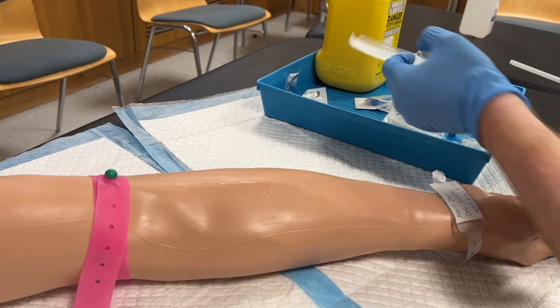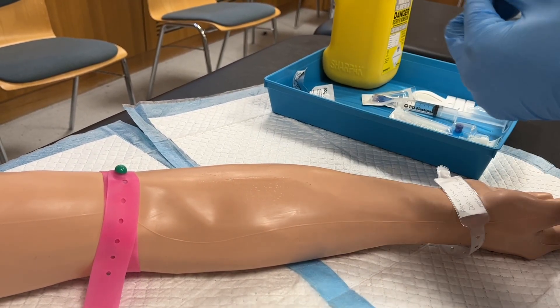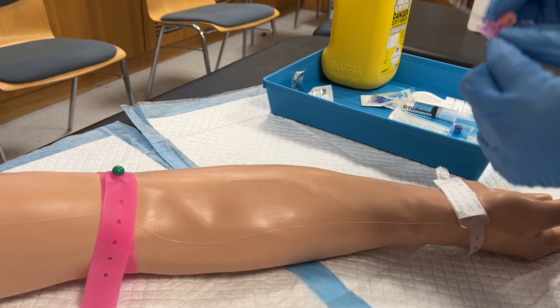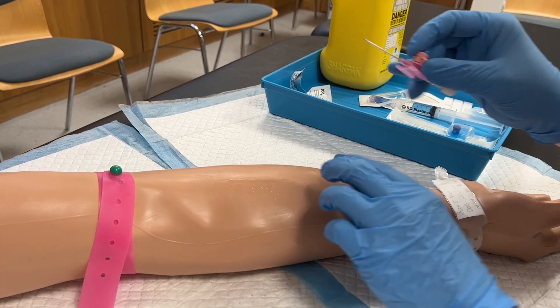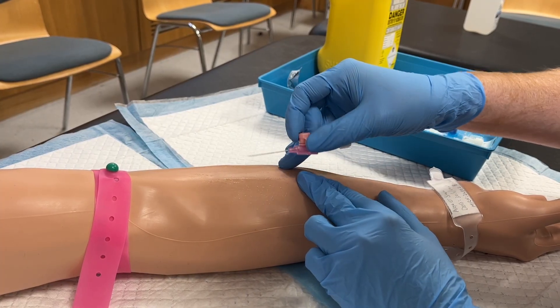Ensure that the bevel is facing up, and in this particular model that the wings have been extended. You will notice me use my non-dominant hand to pull tension in the skin and stabilise the vein, while the ring finger of my dominant hand allows me to stabilise my hand against the patient's arm.